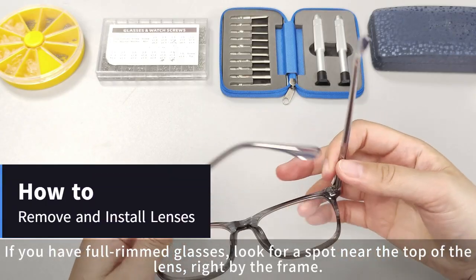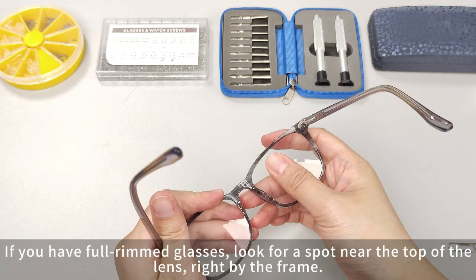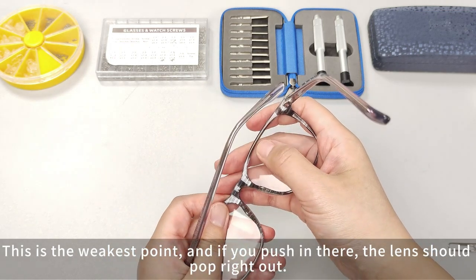If you have full-rim glasses, look for a spot near the top of the lens, right by the frame. This is the weakest point, and if you're pushing there, the lens should pop right out.